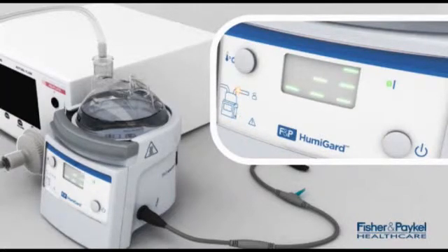Preheat allows the Humiguard system to prepare itself, ready to deliver optimal humidity to the cavity once the surgeon is ready to begin the procedure.